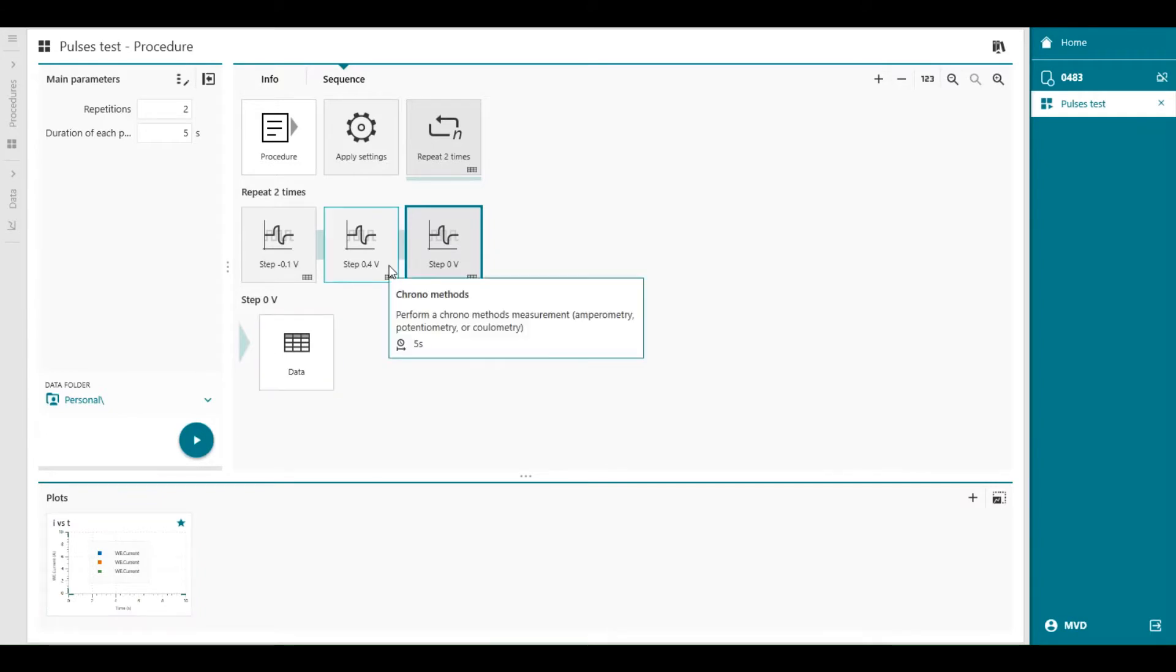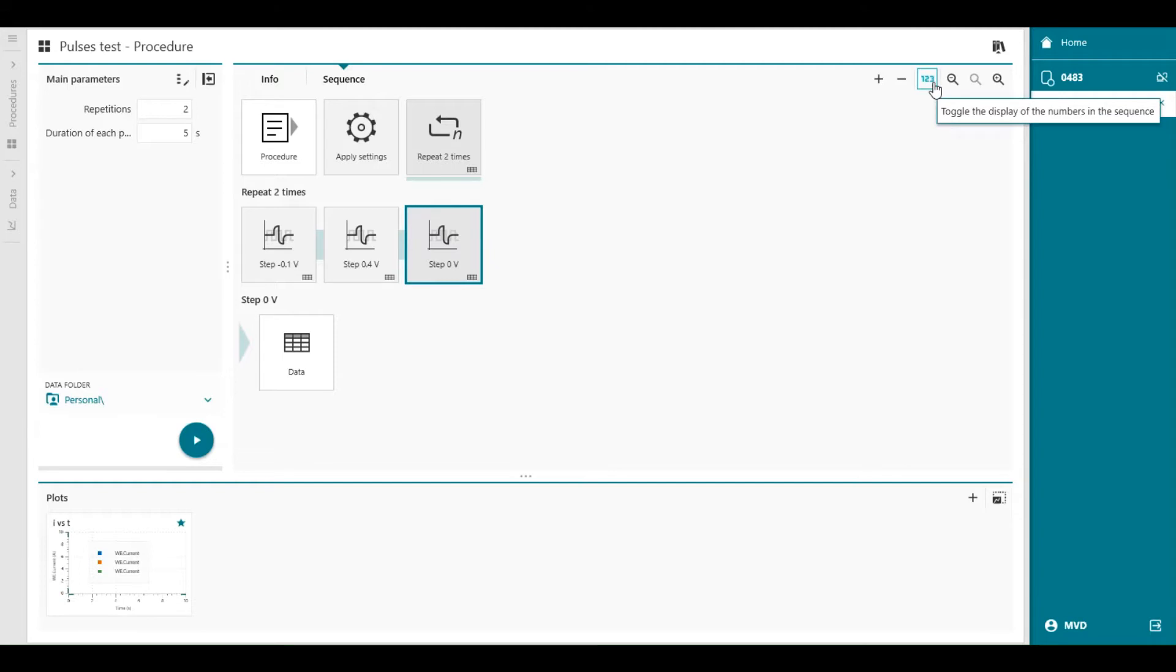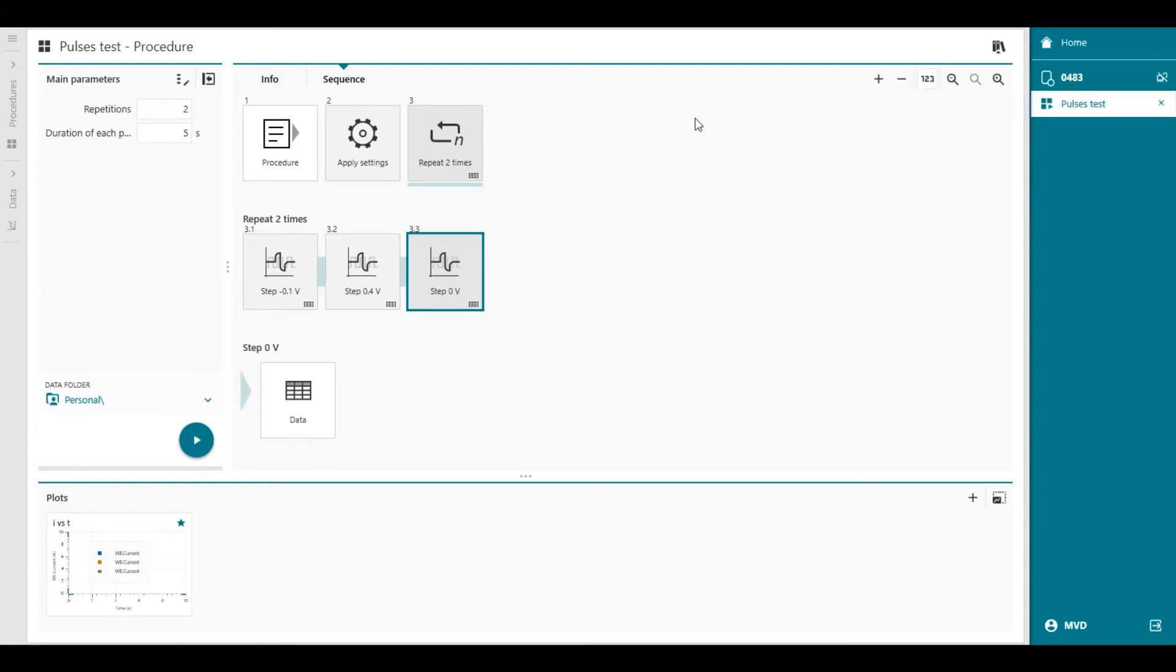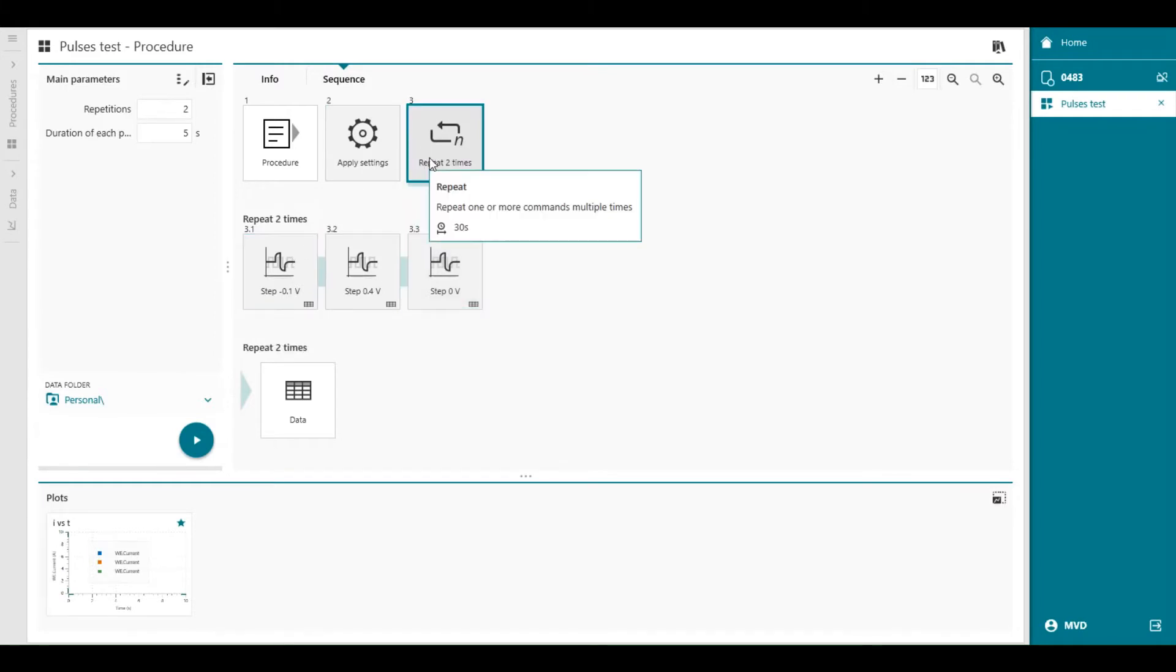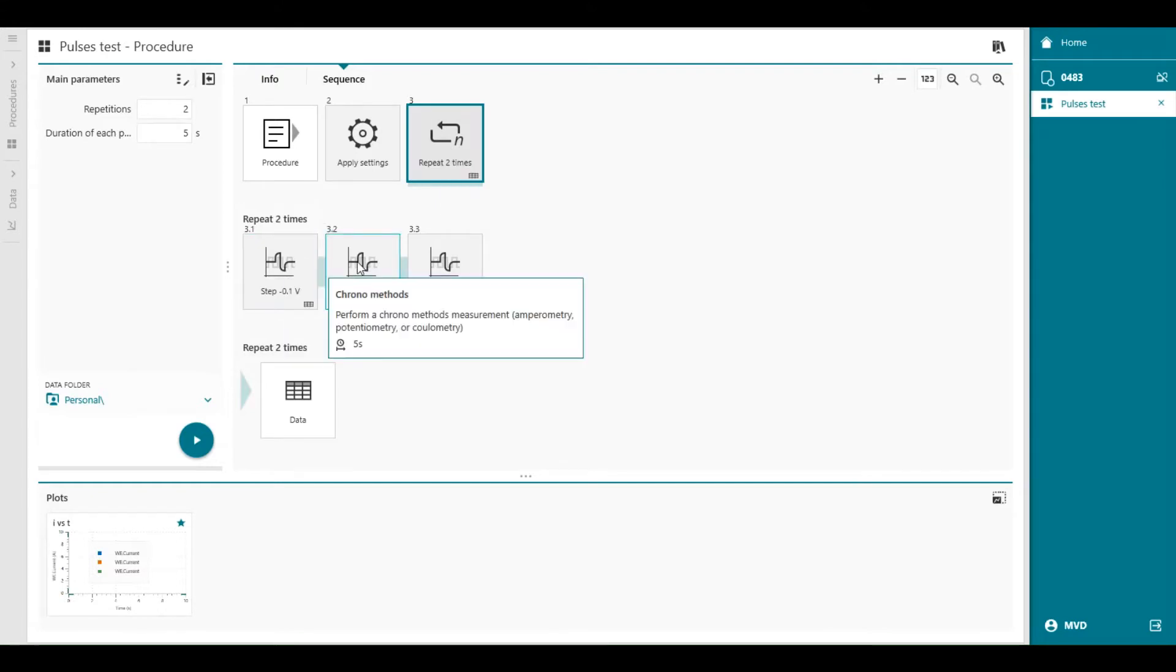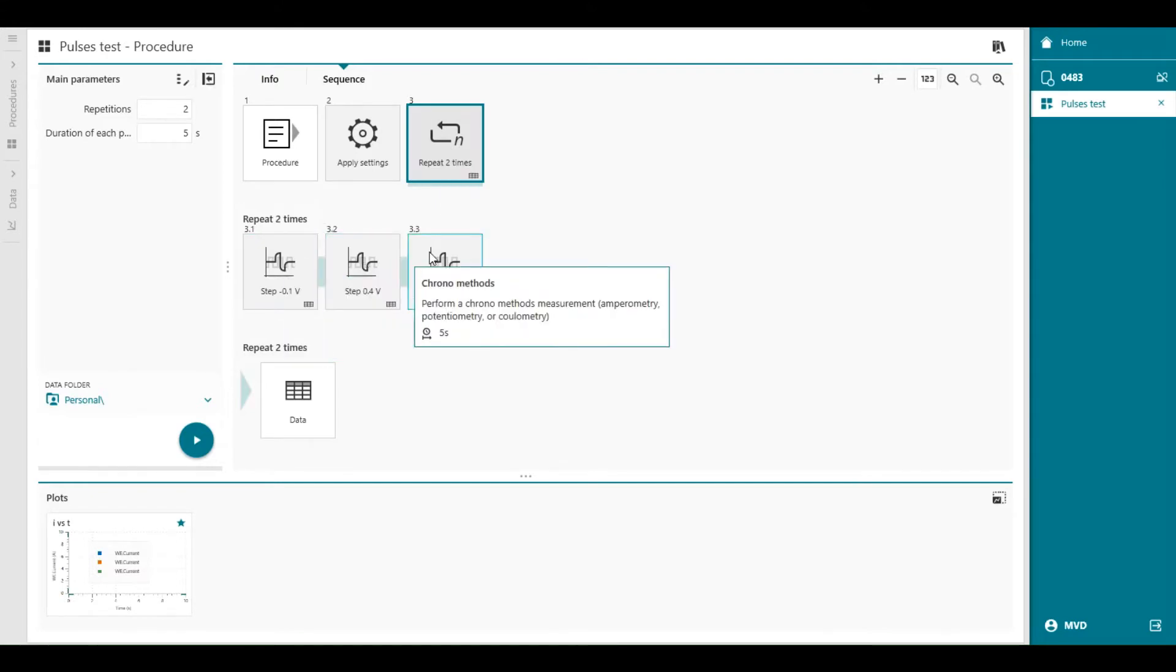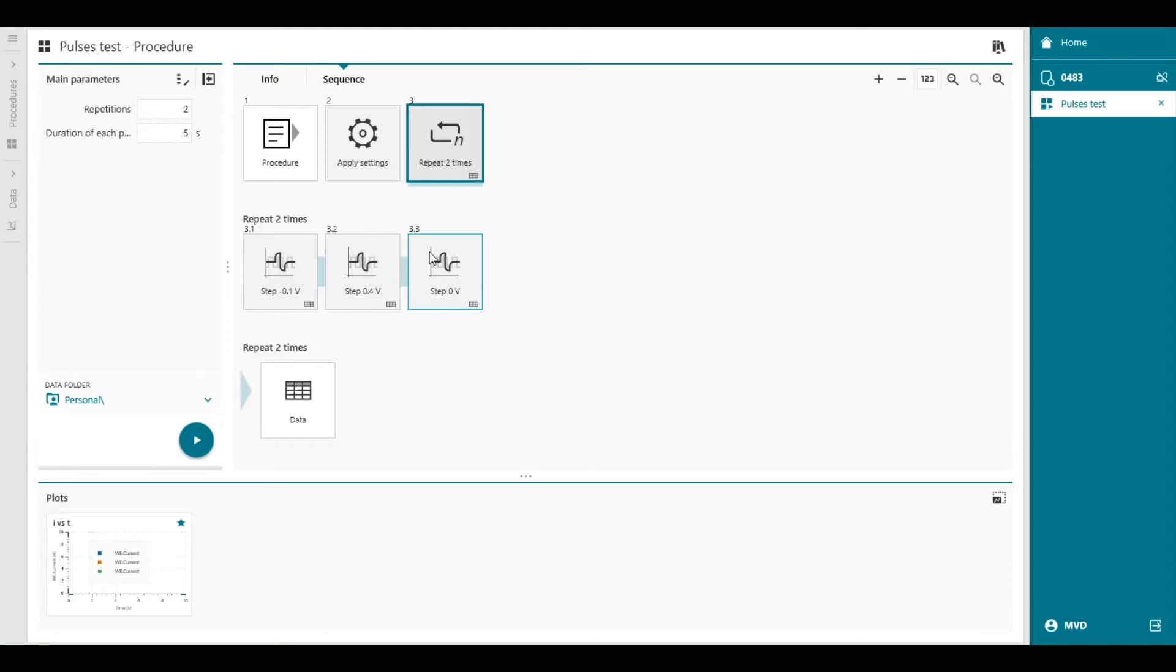Before we continue with optimizing the procedure, let's toggle on the display of the command numbers in the sequence editor. So this one here. It appears as a 123 above the sequence. This is a handy feature, especially for procedures that are going to get complex, with more commands in the same sequence. Each command in the sequence is assigned a number based on its position in the sequence. So the repeat loop has number 3, and under the repeat loop there's number 3.1, 3.2, and 3.3. These numbers are used in various parts of the software to refer to a specific command in the sequence. For example, in the main parameter dialog.